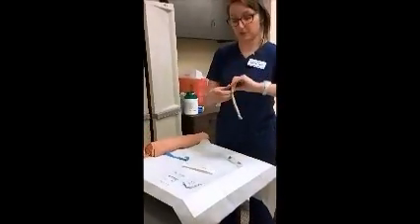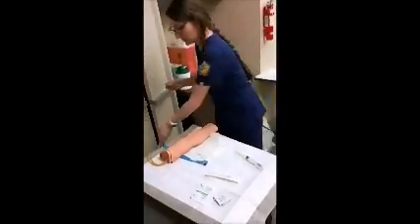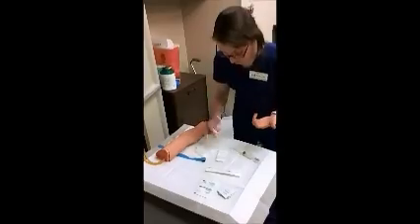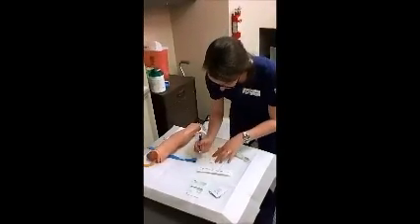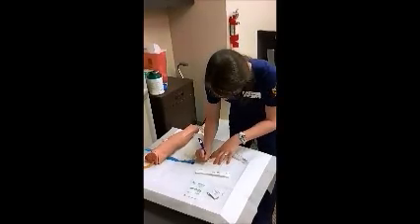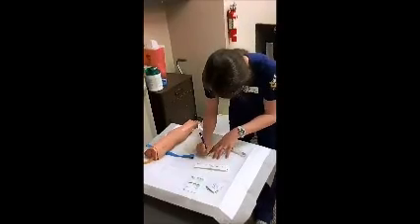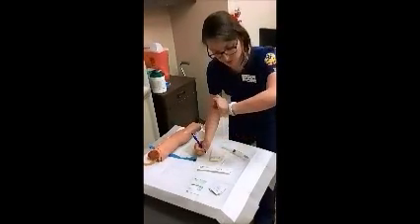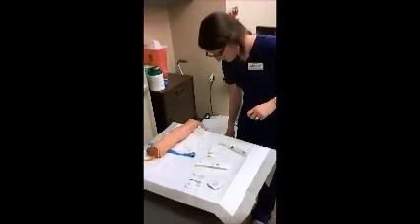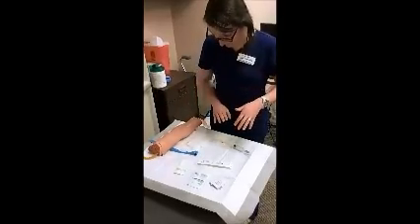This is our Tegaderm that we're going to be using to cover the patient's IV site. And this has a nice spot in here to write the date, the patient's initials, and the nurse's initials. So the date today is 4/4/18. Patient's initials are JS, and the nurse's initials are mine. And then I would also put the time of the insertion, which was at 13:28. Now, we've got that all pretty ready to go.